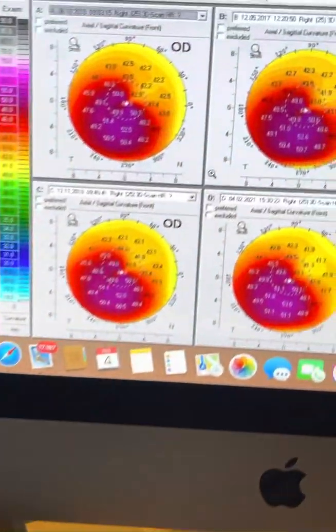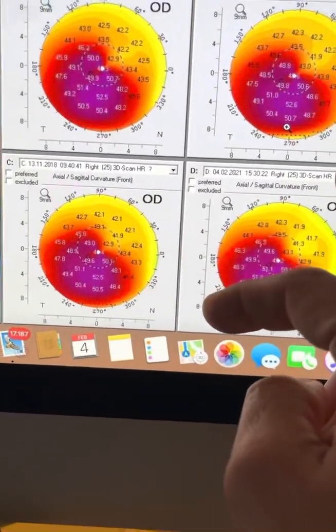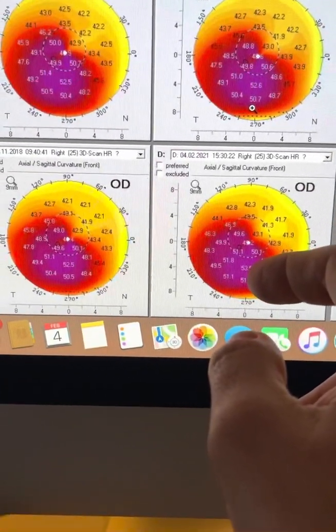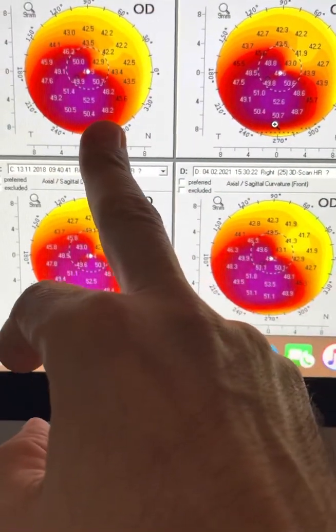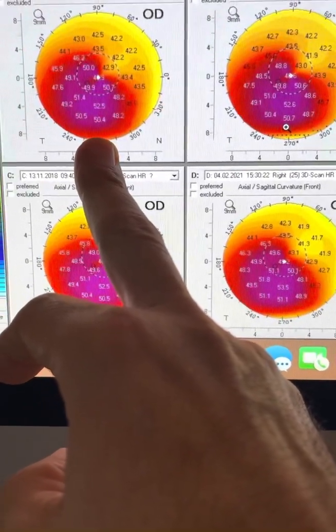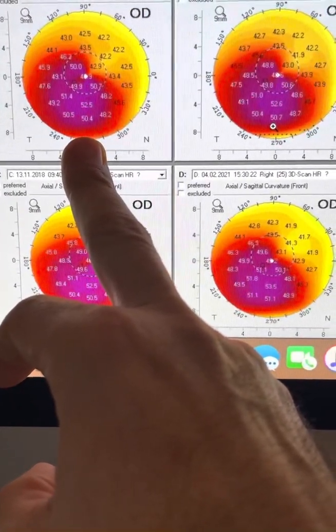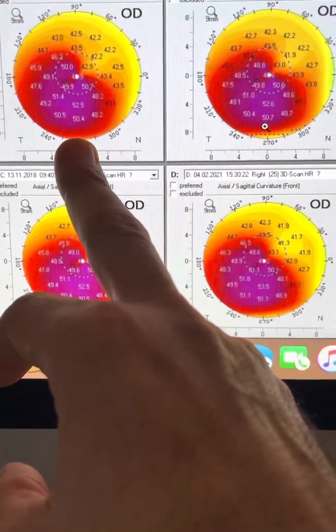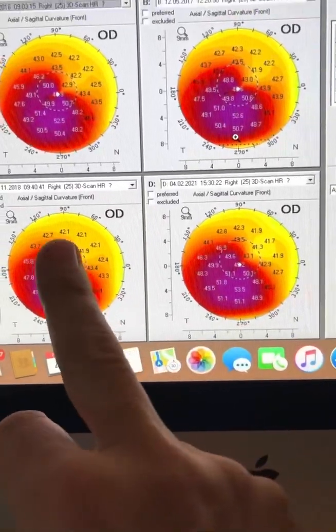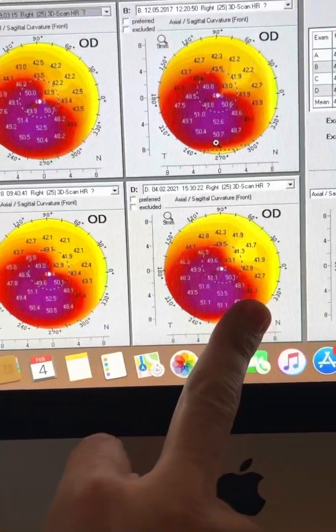We have here a very long follow-up on the right eye of a young lady. She's currently 32, actually she got married, she's planning on having children. We saw her in 2016 with this cone. We performed trans-epithelial corneal cross-linking, refractive cross-linking with the Avidro KXL2 device, currently called the Mosaic. We have her in 2017, we have her in 2018, and today, 2021.